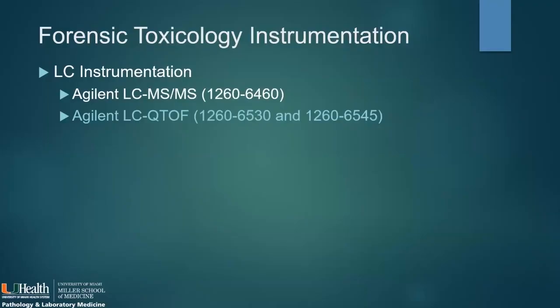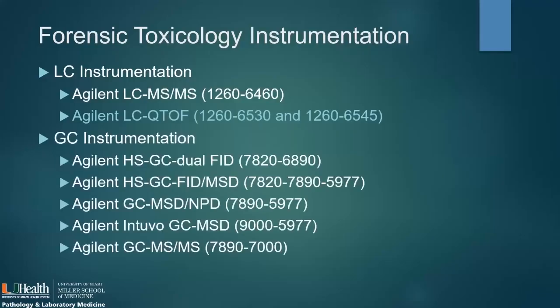So for our instrumentation, I just wanted to give an overview. We do have 2 Agilent LC triple quads, 6460s. We have 2 Agilent LC QTOFs, which I will be talking about more. And then we have a variety of GC instrumentation as well.